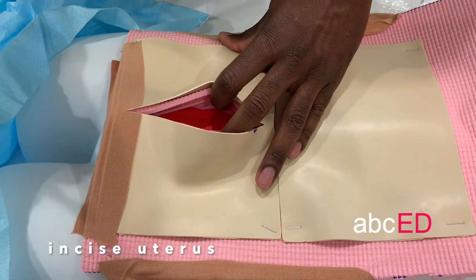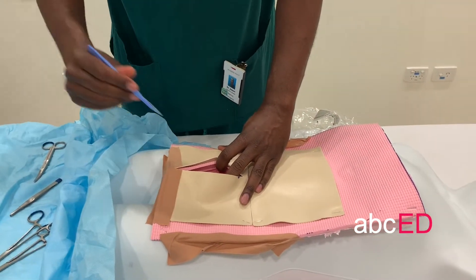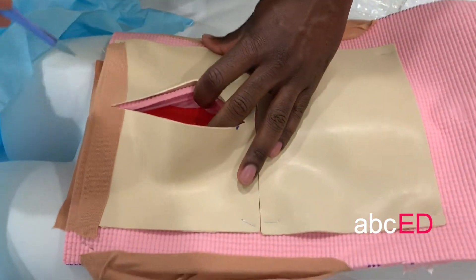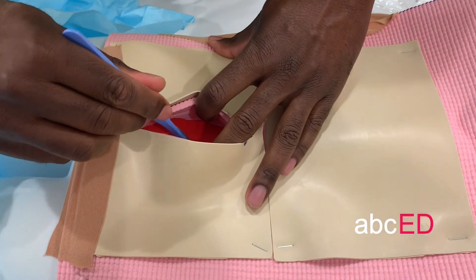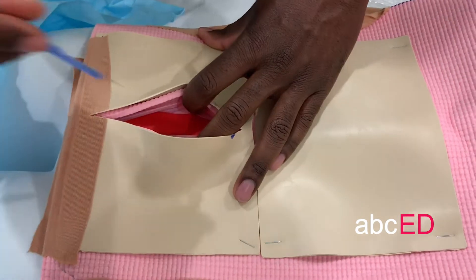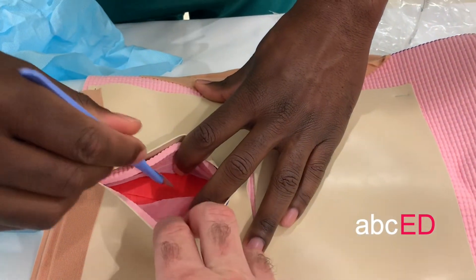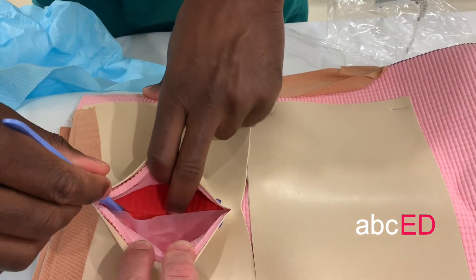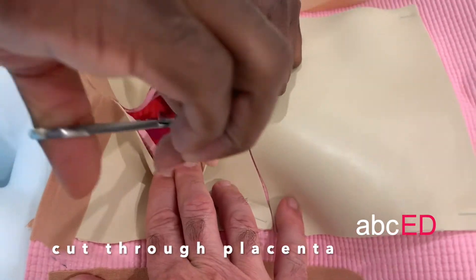At this point, if you have a pair of scissors, this is where you want to be careful — you don't want to cut the baby as you're cutting the uterus. You can incise with a scalpel, just taking care. If you've got an assistant, you can get them to hold the layers apart to improve visibility, and then you can cut through the placenta with a pair of scissors.